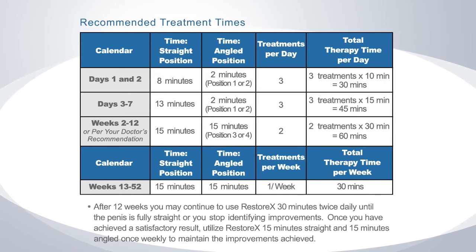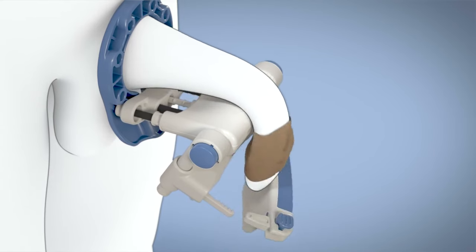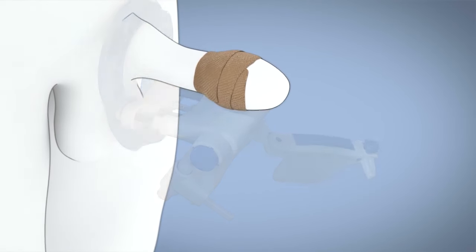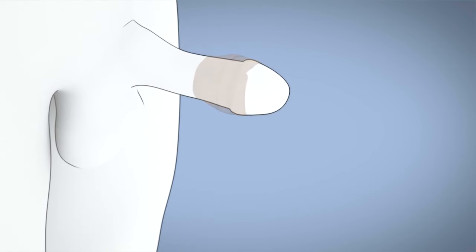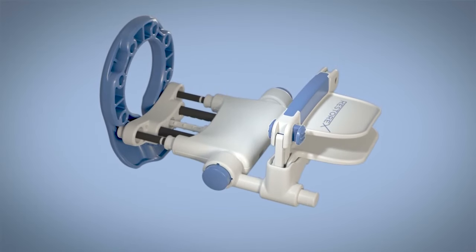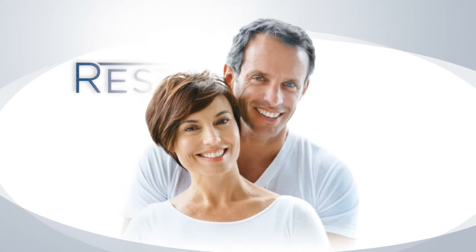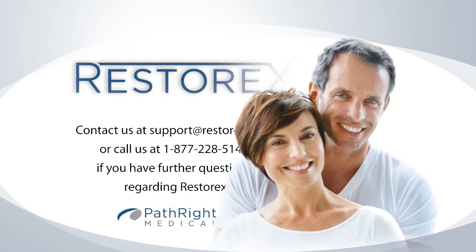The following chart contains the recommended treatment times for Restorex. Start slowly during the first week of use, working your way up to two 30-minute treatments per day. At the end of the treatment time, simply open the clamp, remove Restorex, and remove the self-adherent wrap if used. Remember to always store with the springs untensioned. Read the instructions completely prior to use and use only as directed.